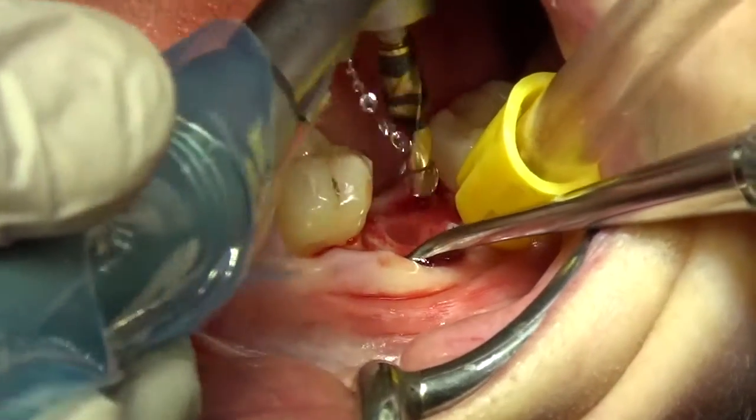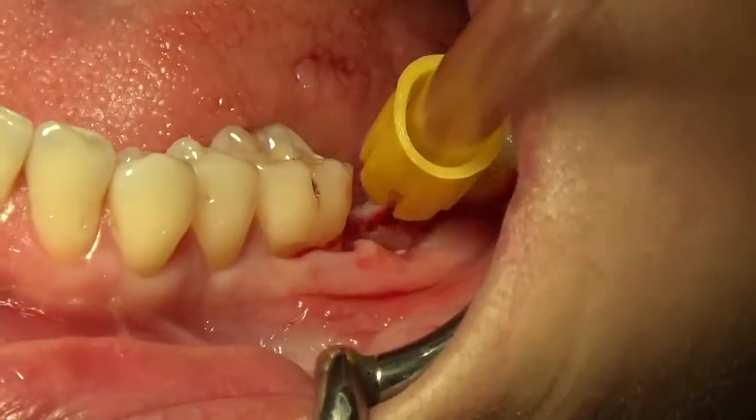And I'm actually going to end up using the longer one to get down there better.